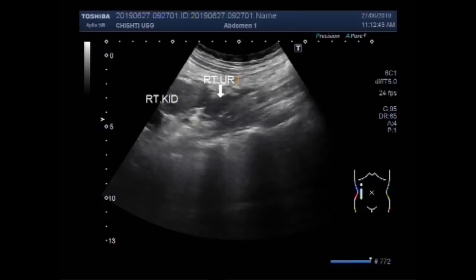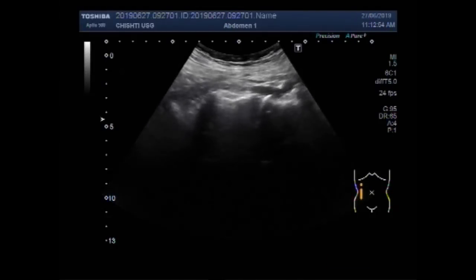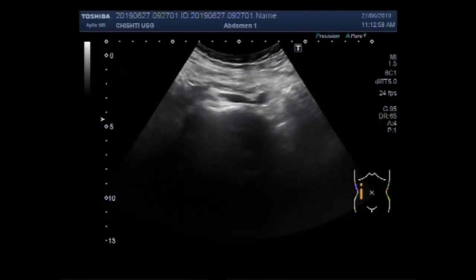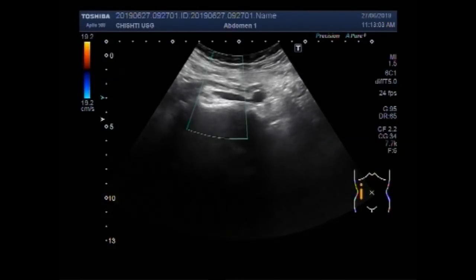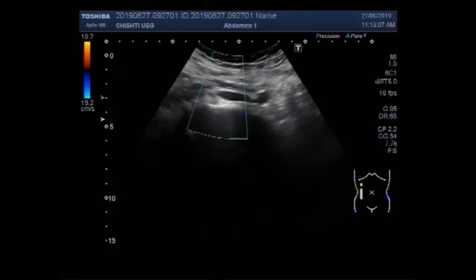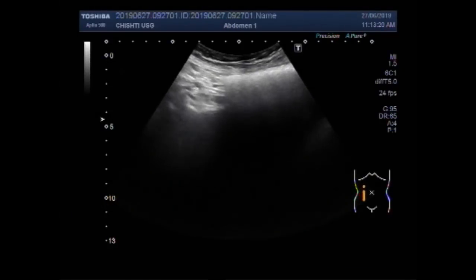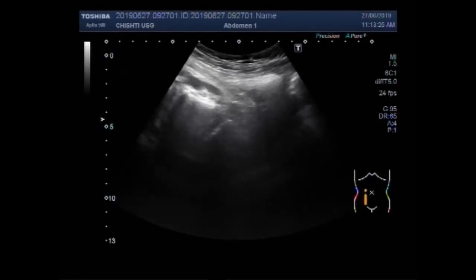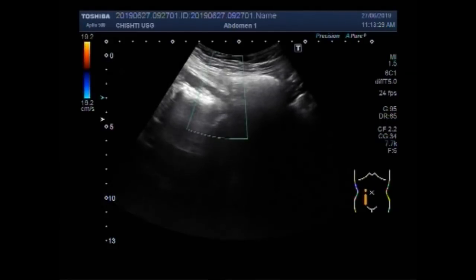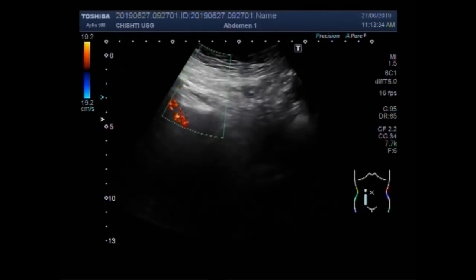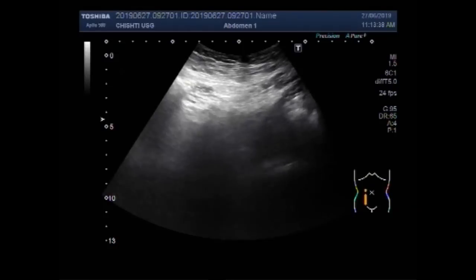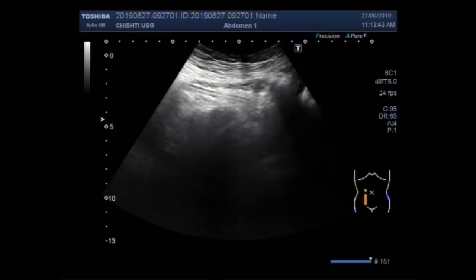This is the right ureter, but it is very difficult to trace it because the stone lies in the distal portion of the ureter and the size of the stone is very small, so there is minimum hydro-ureter. This is the right ureter. However, it is not prominently visible. These are the blood vessels, and the ureter has minimum dilatation. This is the right ureter again.